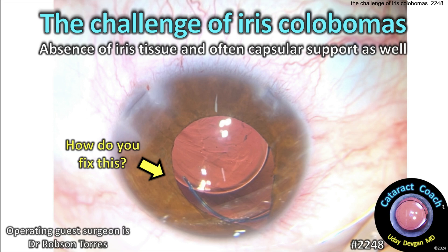CataractCoach.com presents the challenge of iris colobomas — the absence of iris tissue and often capsular support as well.